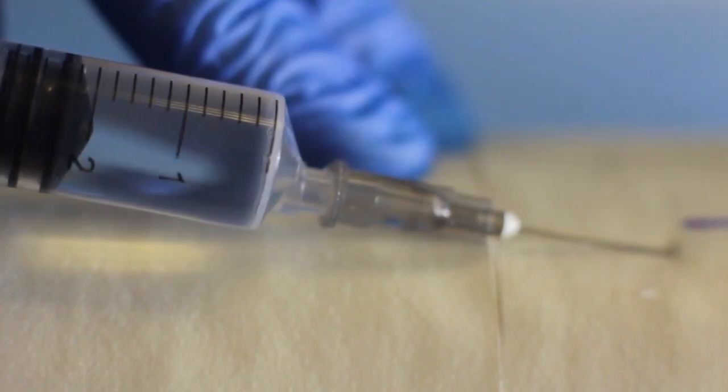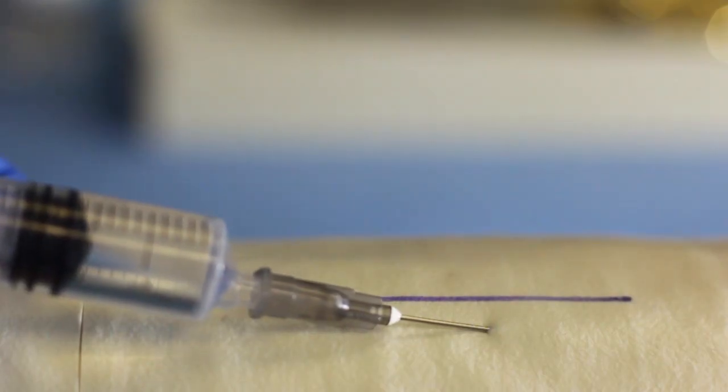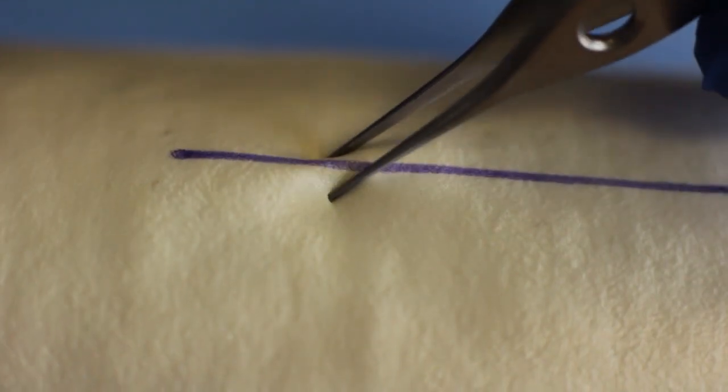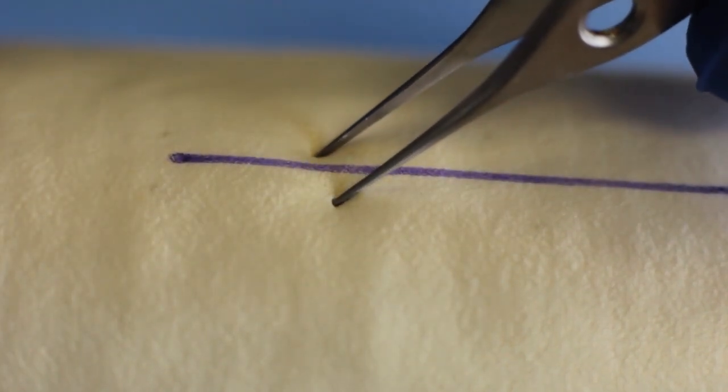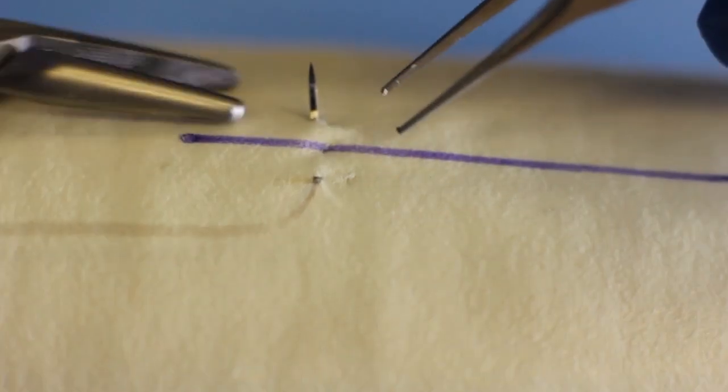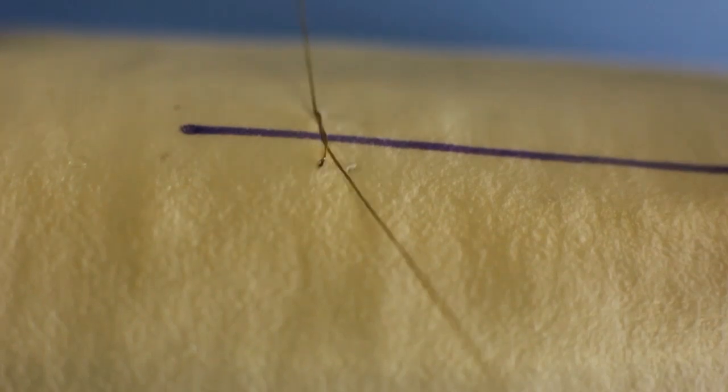Repeat the same procedure on the other side of the laceration. Wait two to three minutes. Test the effectiveness of the local anesthetic by poking the wound area with a sharp probe or by pinching it with a forceps. You are now ready to prepare the wound for suturing.